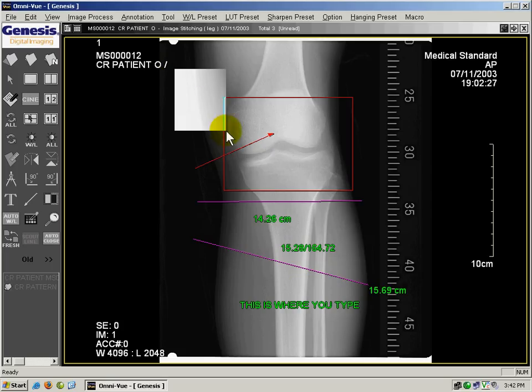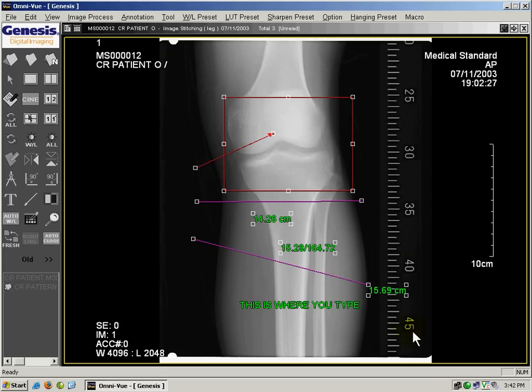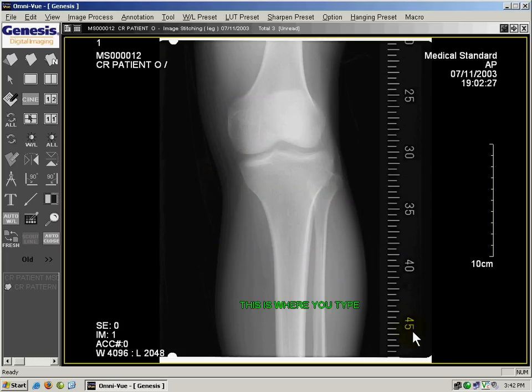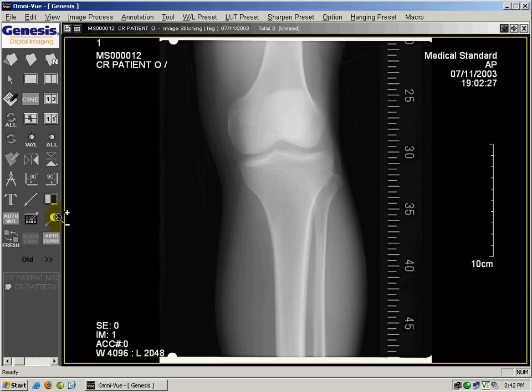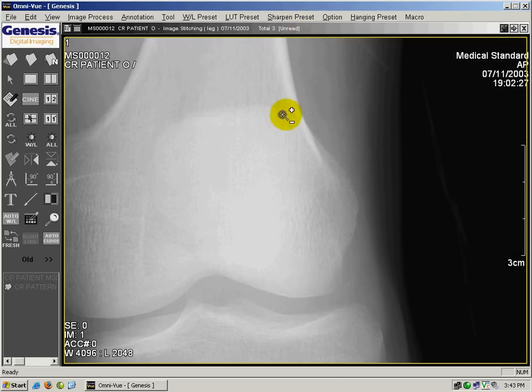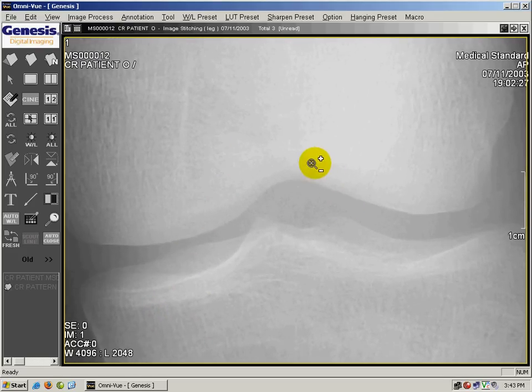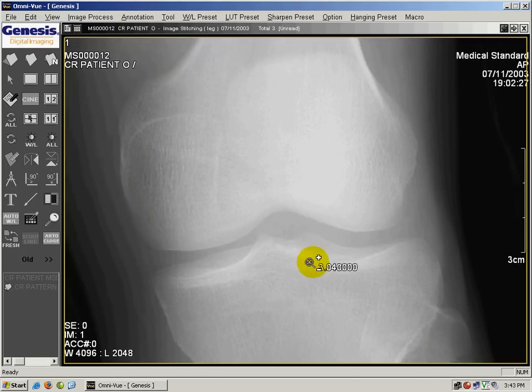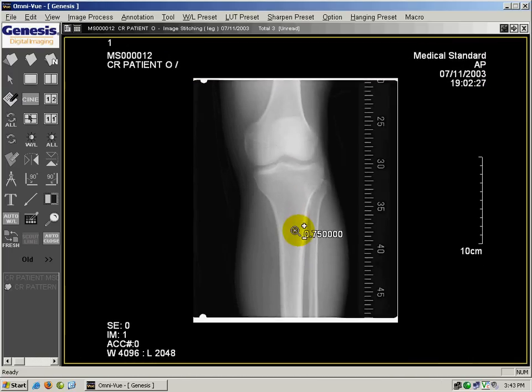I'm going to left click and select everything here and hit the delete key on my keyboard to remove it. You can use the magnifying glass to zoom in and out of the image — left click on the area that you want to zoom in on and move the cursor up to zoom in. You do the same thing by moving the cursor down to zoom out.